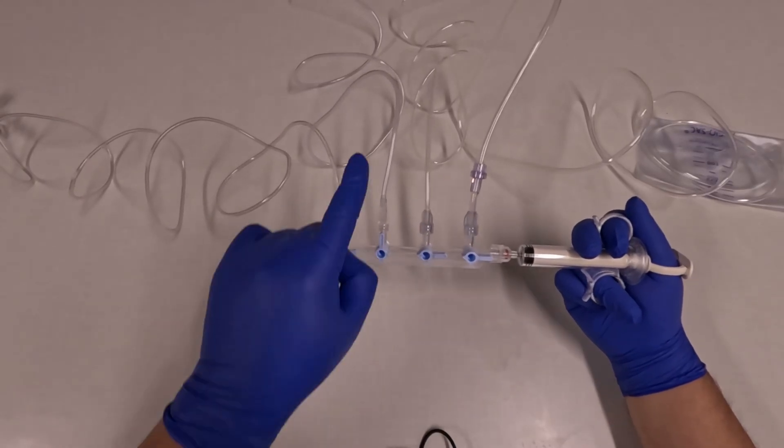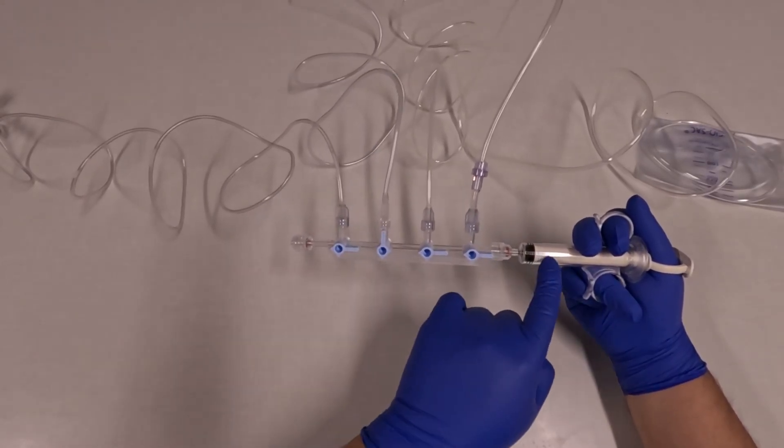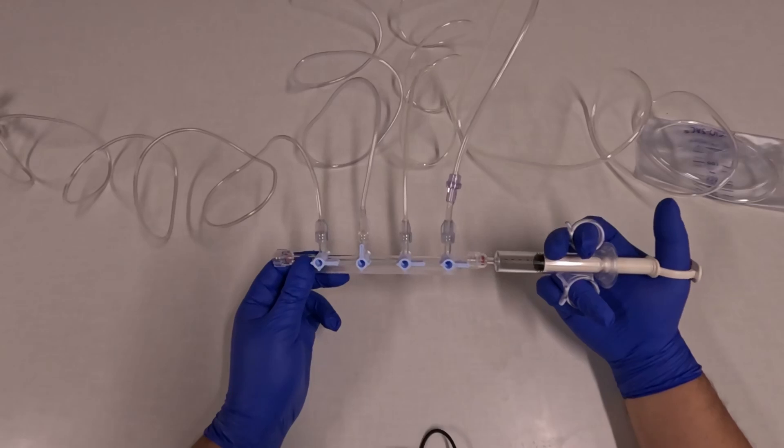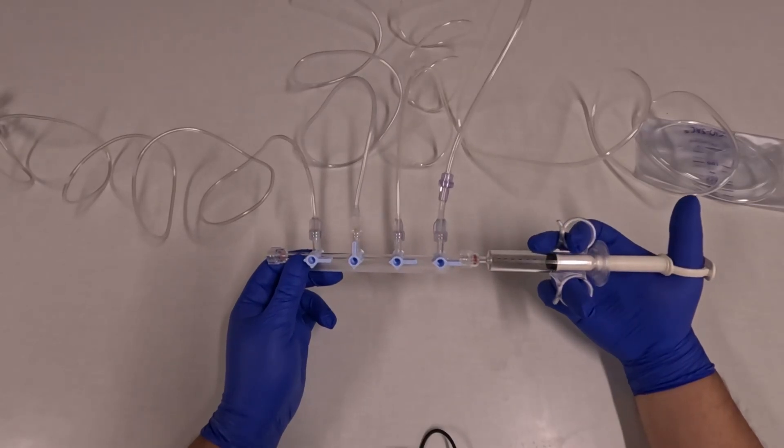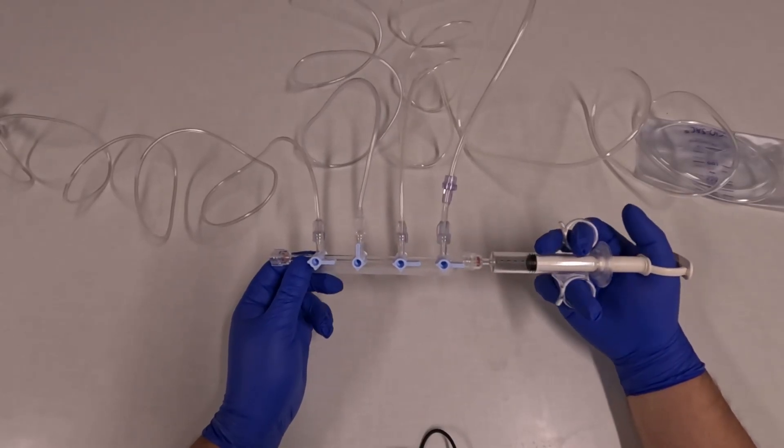If I turn the fluid port up, now there's a path from fluid to my syringe. So when I pull back, I'll pull fluid from the fluid bag to my syringe.